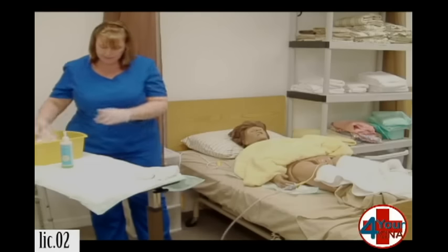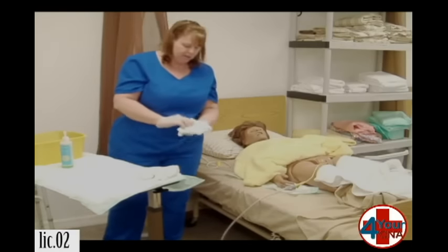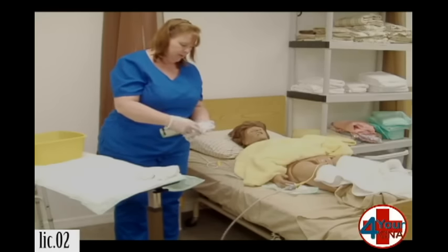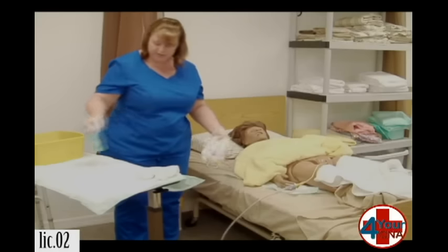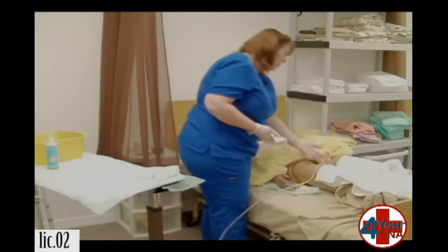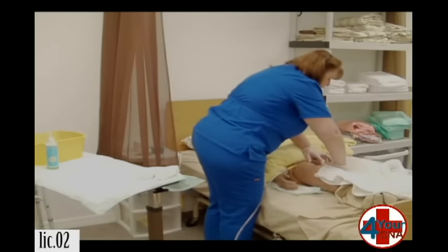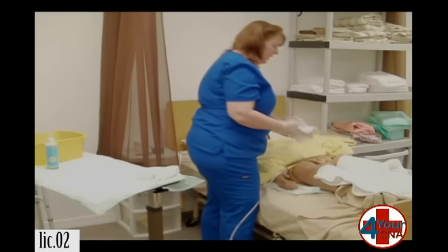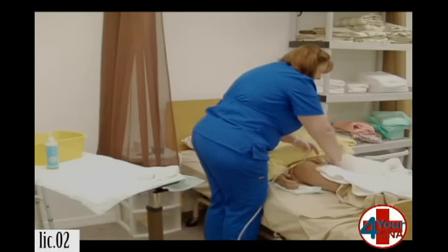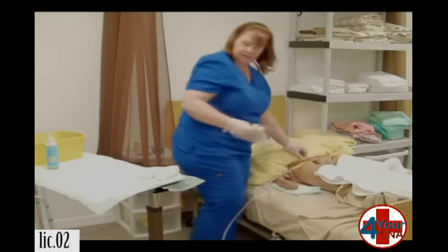Now that the tubing is clean, I have to clean the area around the tubing, Ms. Jones. So I'm going to wring the washcloth out and I'm going to soak five corners. Three. Four. And the back side of the fourth one is the fifth. I'm going to hold you open for just a moment and clean down the center. I'm going to pull the catheter out of the way, hold you open, and clean once right down the center. Fold that over. We're going to clean the outside down one side, the outside down the other side. Fold it over. Skin fold. Skin fold. And skin fold. Set that aside.